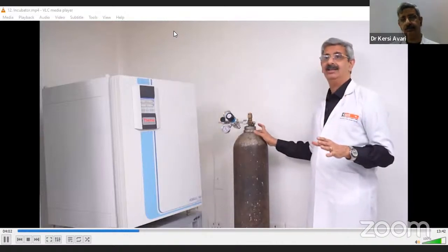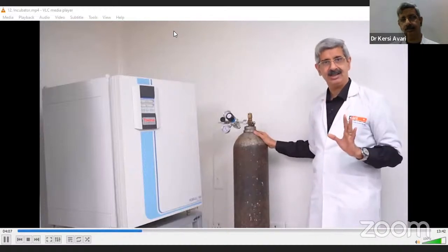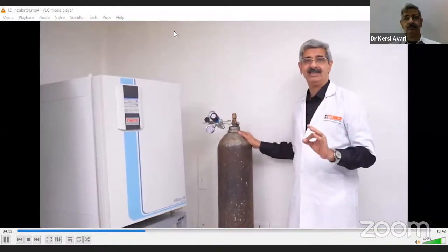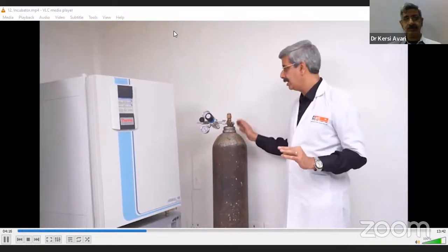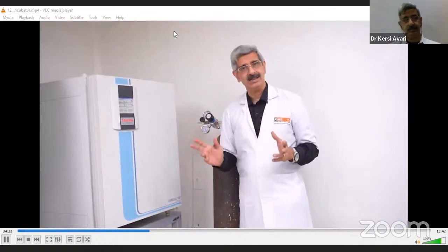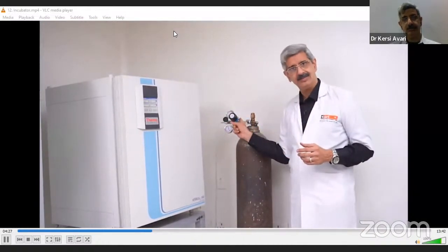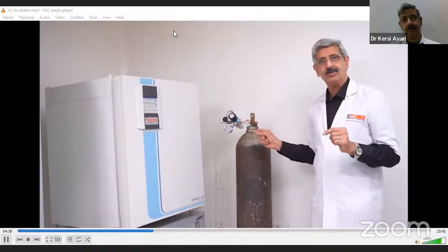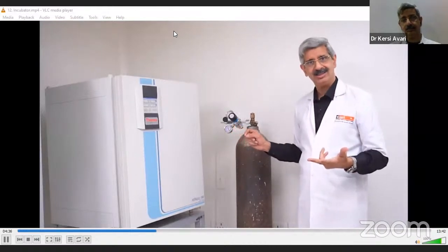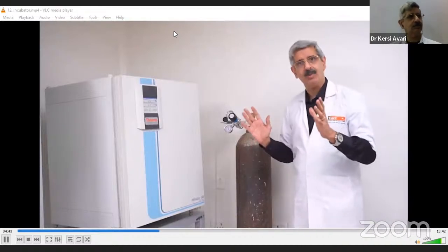And always remember, you keep a backup CO2 cylinder in case of an ultra emergency. And your in-house embryologist should know how to replace, in an emergency situation, a backup regulator. So there are certain gadgets which need to be in duplicate in an embryology lab. One is a regulator. Second, the bulbs of the microscope, because they are not easily available over the counter. A centrifuge machine, and with your work progressing in bulk, a backup ovum aspiration pump.